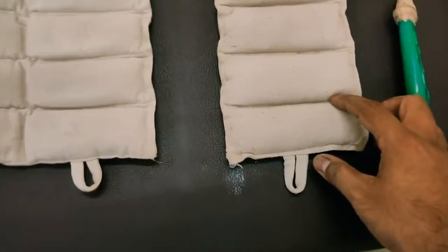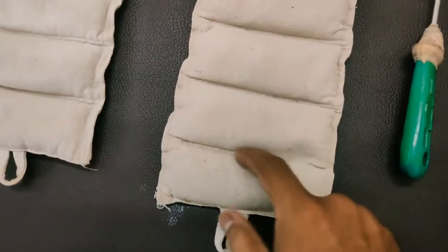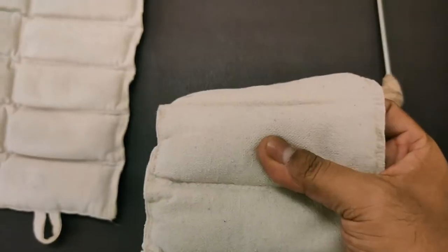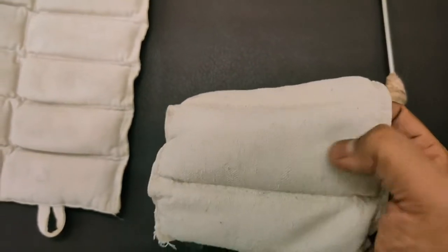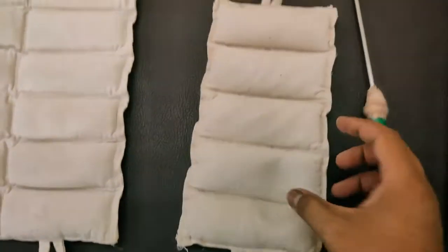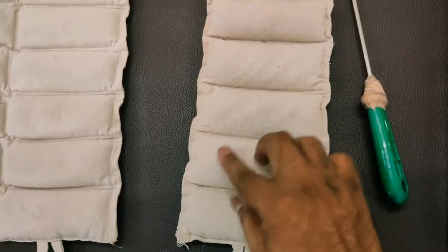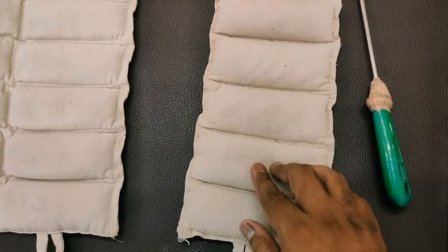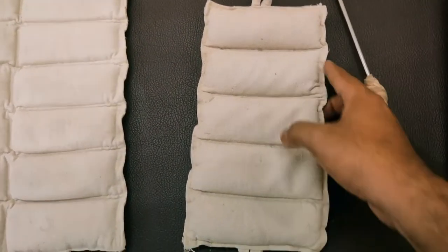The pack is made up of fabric, and inside there are bentonite crystals. The advantage of bentonite crystals is that they absorb heat and retain it properly, so that when applied to the body, the heat can be delivered for a longer period of time.